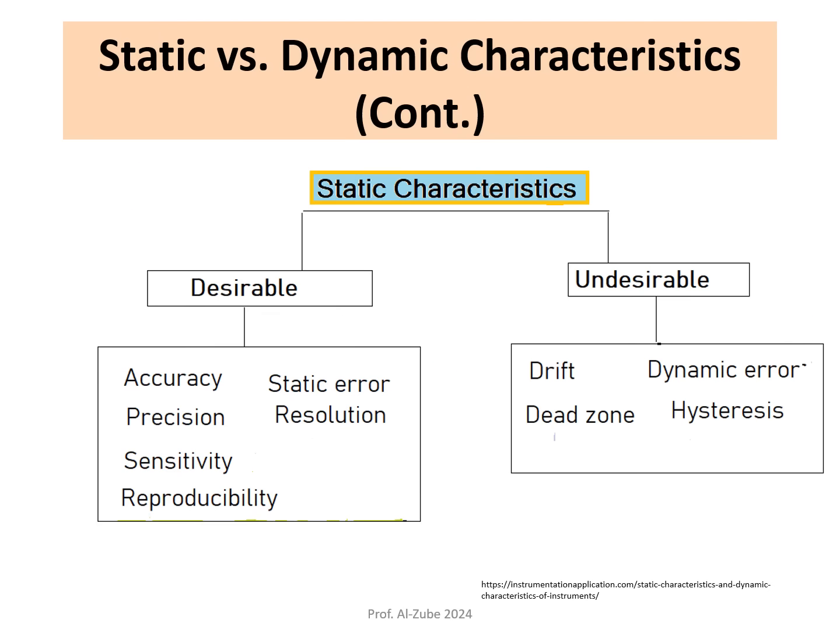Now I have a couple of examples for you about what those characteristics are. I will start with the static characteristics of biomedical instrumentation. If you have a medical instrument and you want to see if it is the thing that you would like to buy, and you saw two, let's say, blood glucose measurement instruments, and one of them is very expensive and one of them is cheaper, why is one expensive and the other cheap? It all depends on their characteristics.